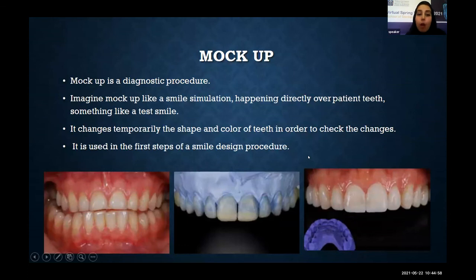After wax-up, we have mock-up. Mock-up is a diagnostic procedure, and mock-up is like a smile simulation happening directly over patient teeth, something like a test smile. Actually, it changes temporarily the shape and color of teeth in order to check the changes. And it is used in the first step of a smile design procedure. You can see here the pre-op view of the patient, the wax-up, and the mock-up.